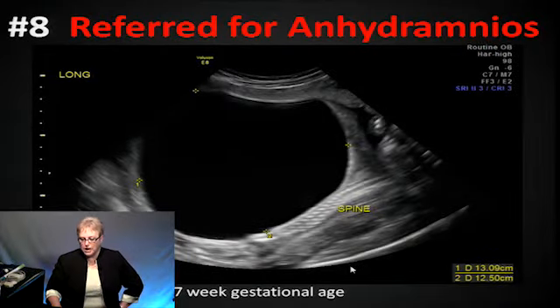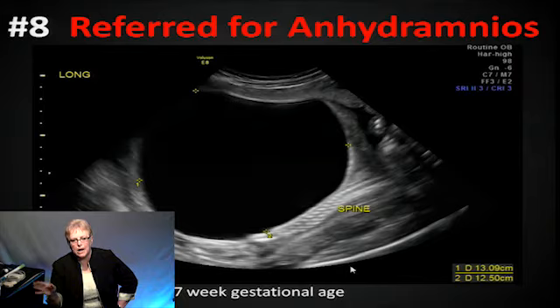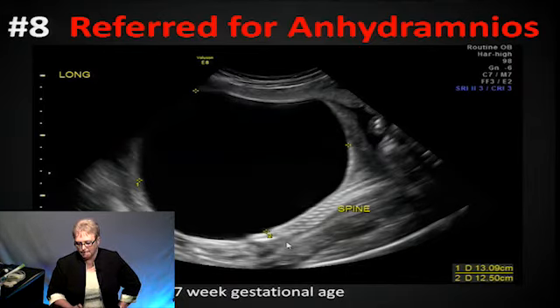All right, moving on. Still one more abdomen thing. This patient was referred at 17 weeks for anhydramnios, so we could see no measurable fluid outside of the fetus. This is the spine, this is the pelvis, this is the baby's tummy. Up in here is a little bit of the chest, and way up here is the head, and a little bit of the arm.